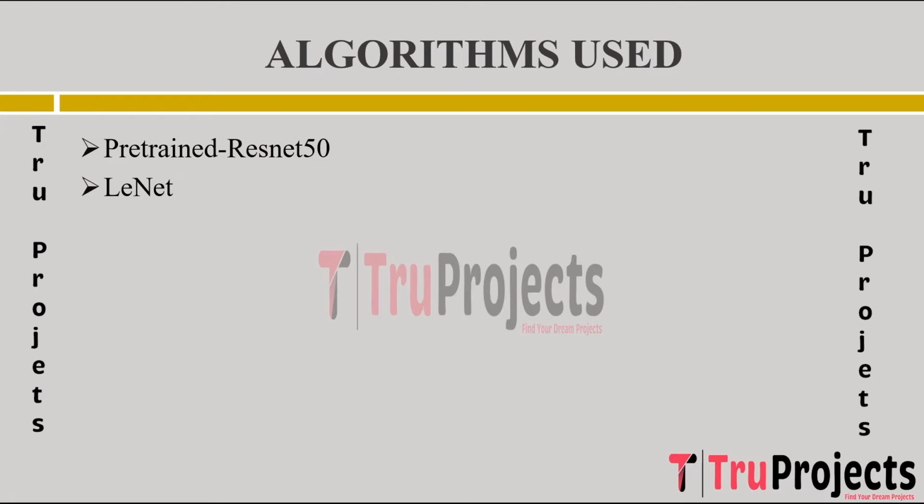ResNet-50, being a pre-trained model, is employed in the project for feature extraction from MRI images. The model's convolutional layers learn to extract hierarchical features from the images. These features are then used to train and classify Alzheimer's disease, normal control, and mild cognitive impairment.